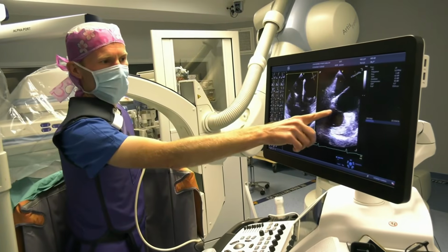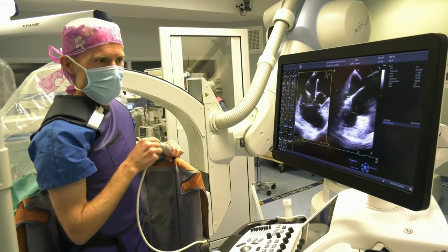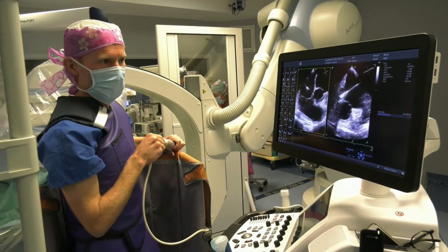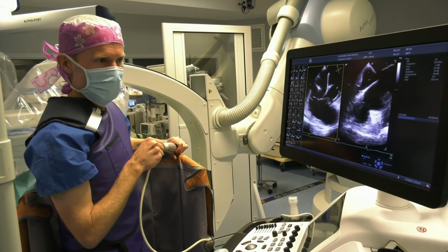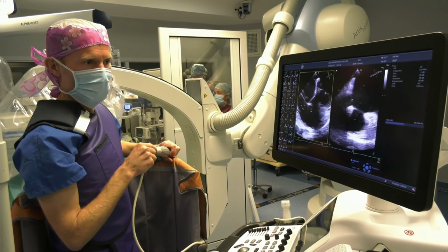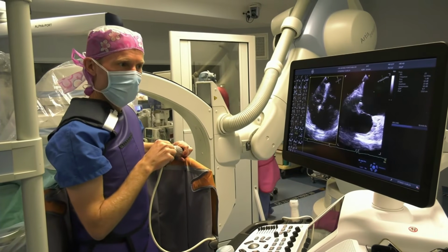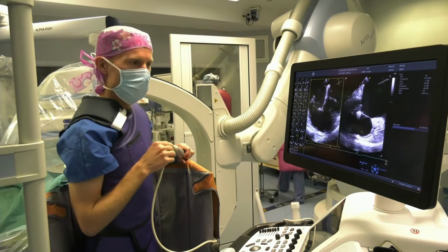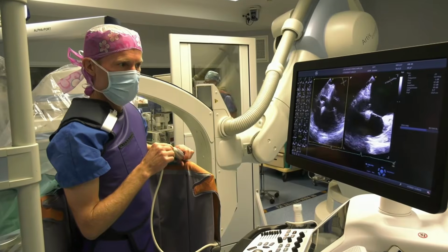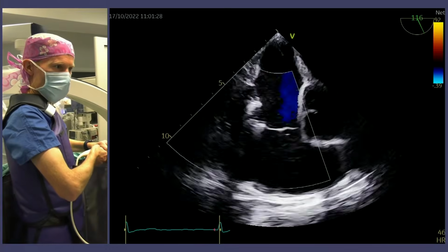So you see both clips are implanted, and we will let the second clip free of the delivery catheter. And it's not moving, it's perfect. We have both clips that are nicely looking at the same direction, which is nice. They are looking at the apex of the right ventricle. So the result is very nice. There is a small jet of regurgitation, but not that much.